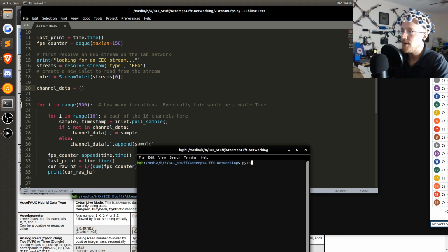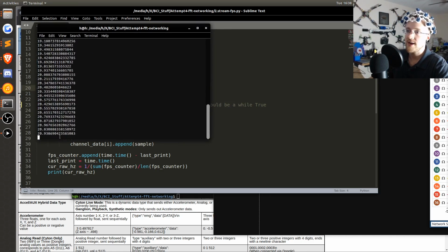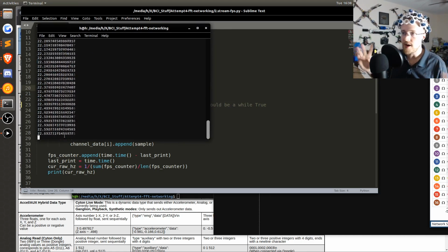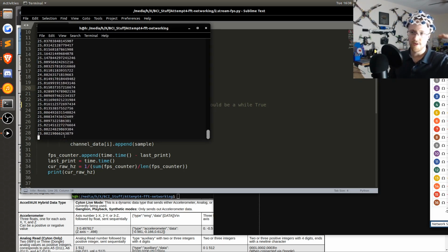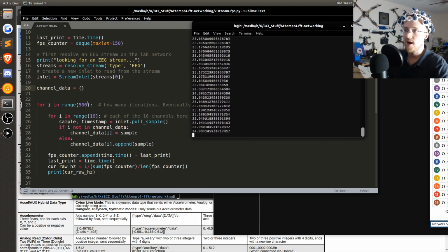And then let me go ahead and open in terminal here. And we'll say Python 3.7 to stream FPS. So this is just the actual frames per second. So we're seeing we're getting about, I don't know, 22, 22, 23, now it's 25. I did notice that it starts off kind of slow and then eventually we'll go to about 25. And then when it's done, we'll actually see the graph, hopefully, if it finishes anytime.